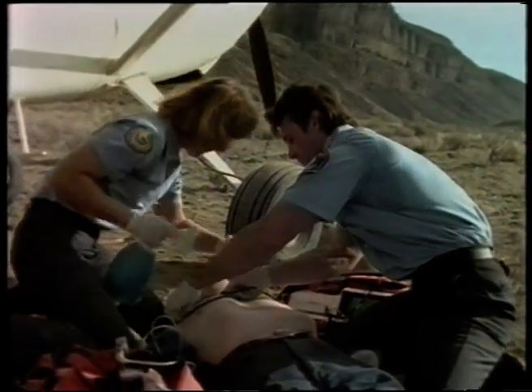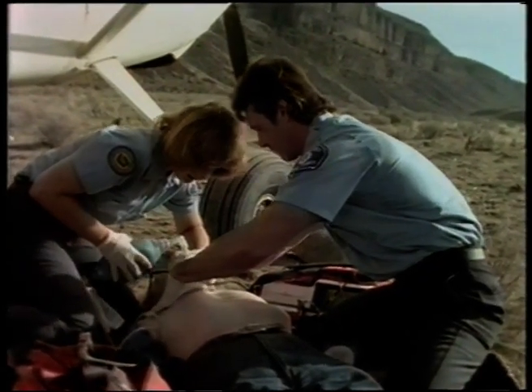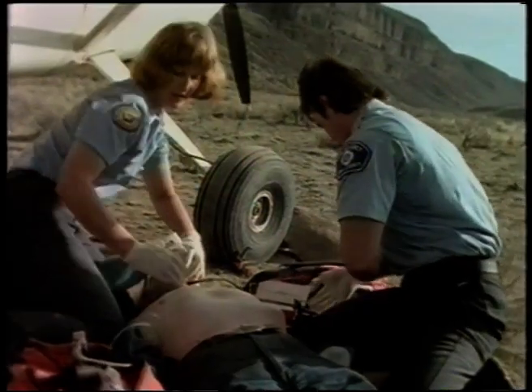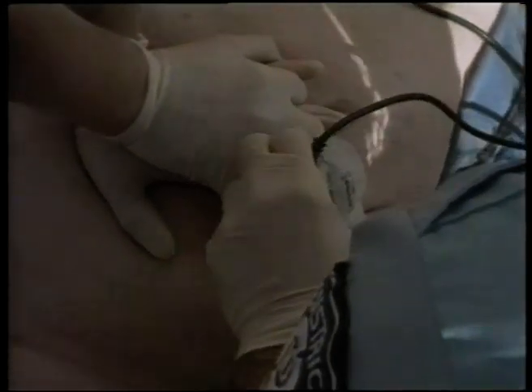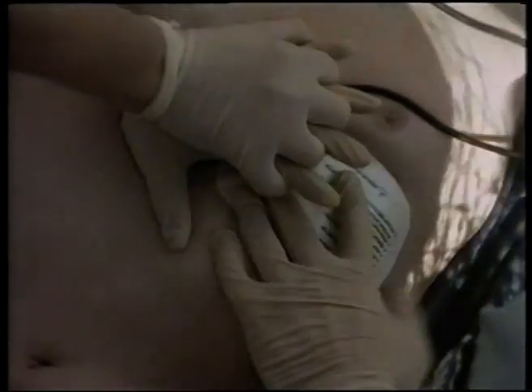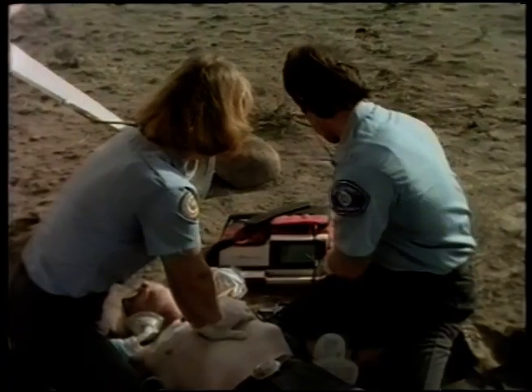Place the electrodes firmly on the patient's chest in the standard anterior-anterior defibrillation position. This is also known as the sternum and apex, or lead 2 position, and is shown on the electrodes. One electrode is placed below the clavicle and slightly to the right of the upper sternum. The other is placed at the apex of the heart, slightly below and to the left of the patient's nipple. Make sure each electrode adheres firmly around its edges to the patient's skin. Now the LIFEPAK 300 is ready to analyze and, if needed, defibrillate.